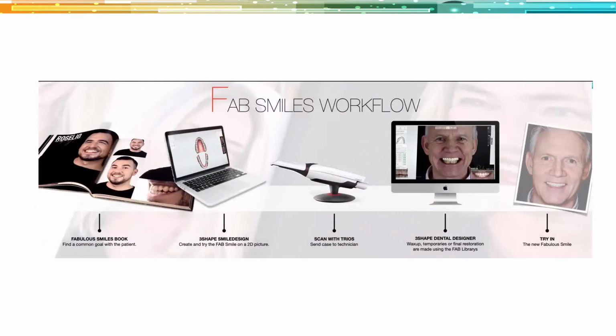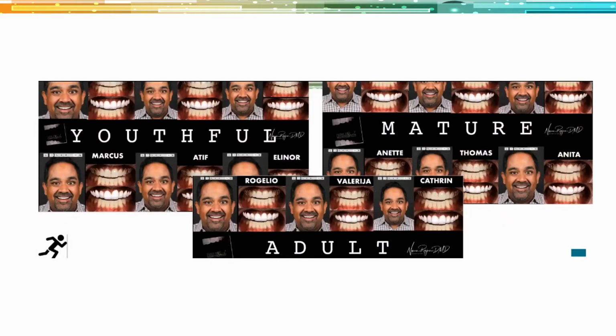And so this emerging trend is basically starting with this book and then using the corresponding library that the patient chooses in Smile Design. We get our digital data with our Trios, and then we actually use all that data to make a digital wax up, and that leads to the try-in, and you'll see that. But I did this exercise on myself where I went to the Fabulous Smiles library and I basically smile designed myself using all 18 libraries.